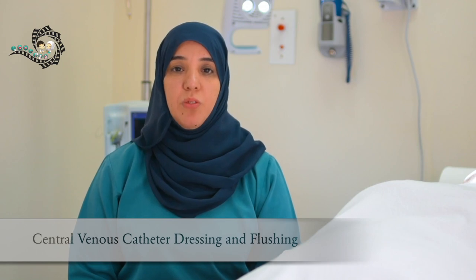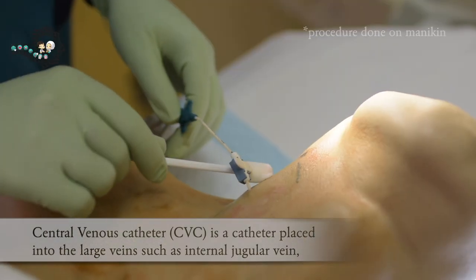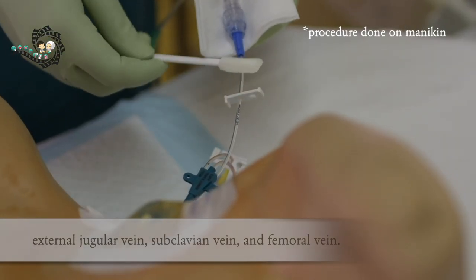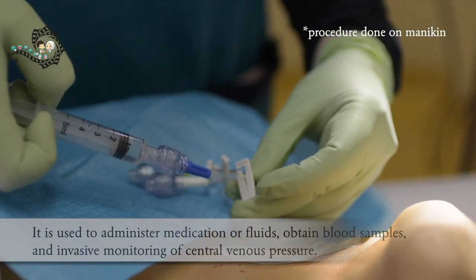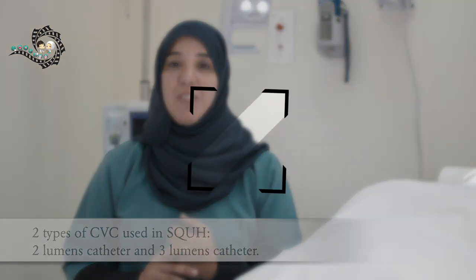Today, I'm going to talk about CVC dressing and flushing. A central venous catheter is a catheter placed into a large vein, such as the internal jugular vein, external jugular vein, subclavian vein, and femoral vein. It's used to administer medication or fluids, obtain blood samples, and for invasive monitoring of central venous pressure. We have two types of CVC used in SQUH, 2 lumens and 3 lumens.